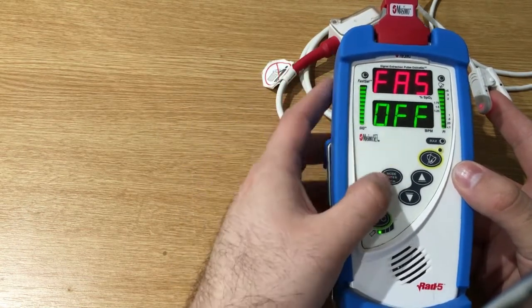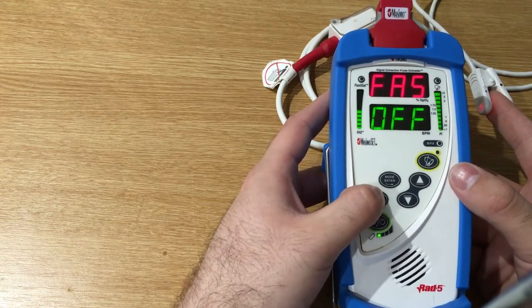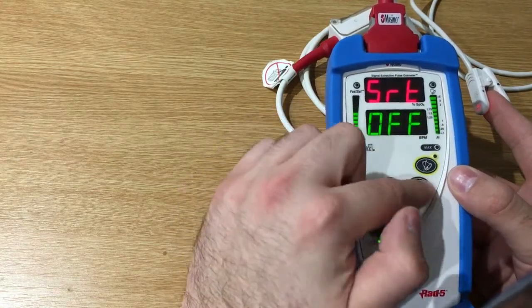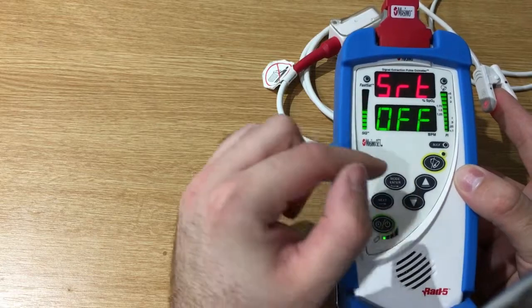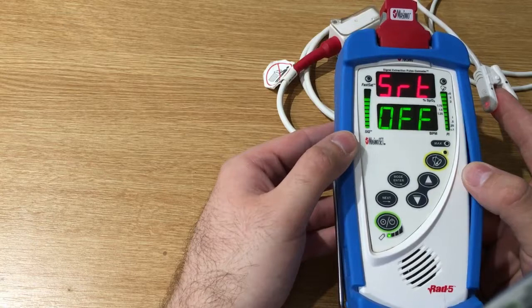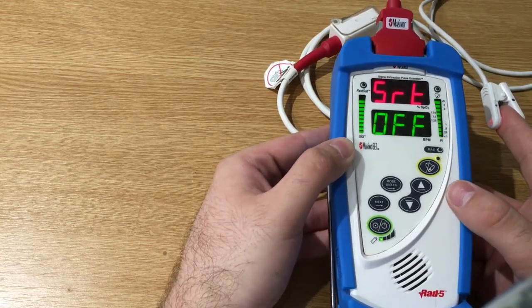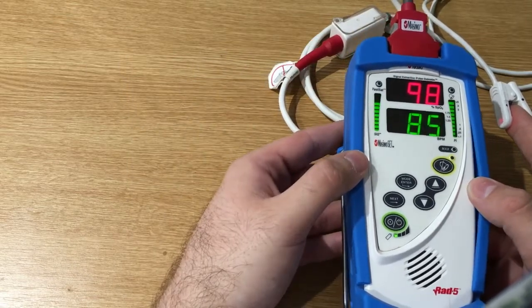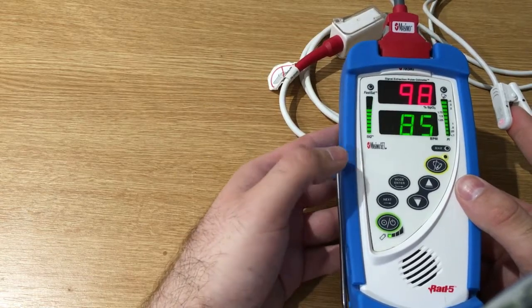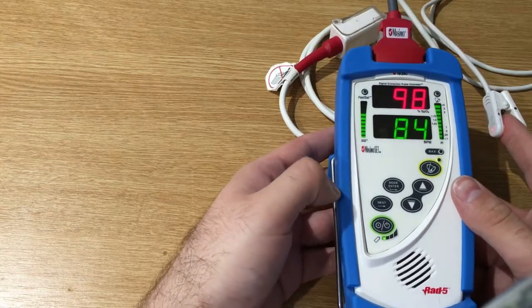And here we can enable or disable the fast sat. Here we can enable or disable the smart tone. So the smart tone basically is a feature that allows this pulse oximeter to identify the arterial wave under low signal-to-noise conditions.